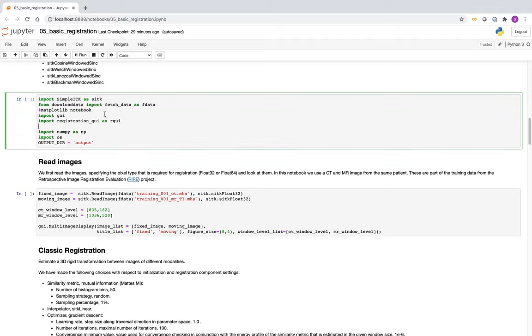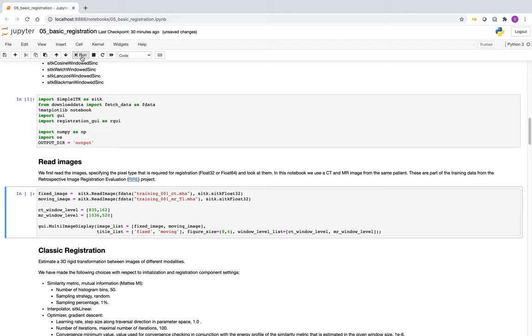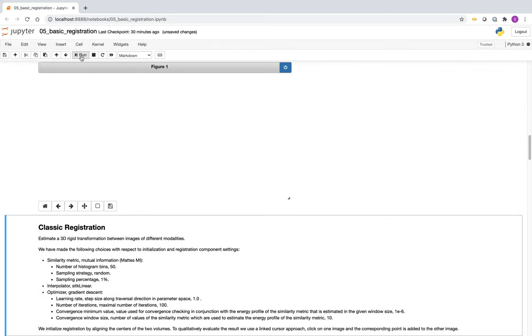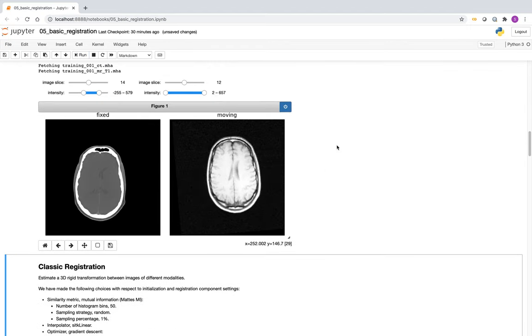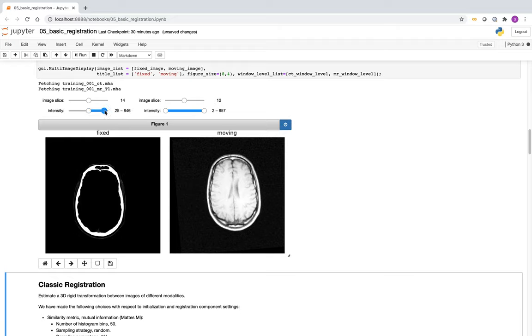Let's start running the notebook. As the first thing, we'll read our two images — one is a CT, the other is an MR. We have a fixed window and level because these are high dynamic range images. We'll modify the intensities so that they are visually clear. The GUI allows us to control the window level for the CT. This is just for visualization purposes.